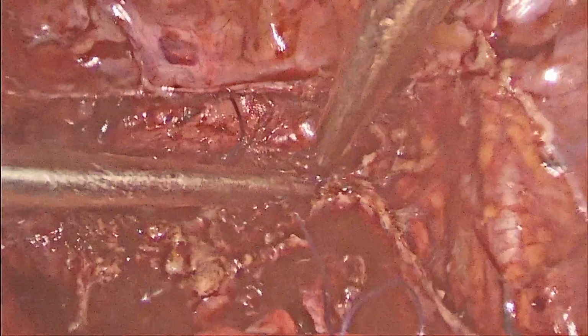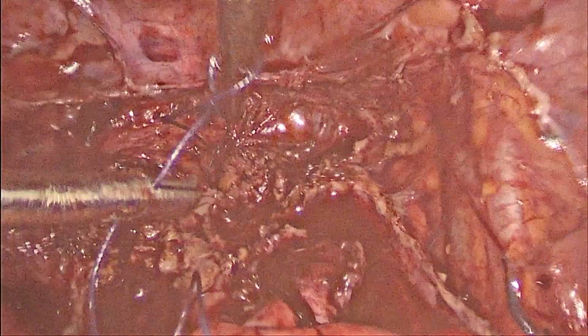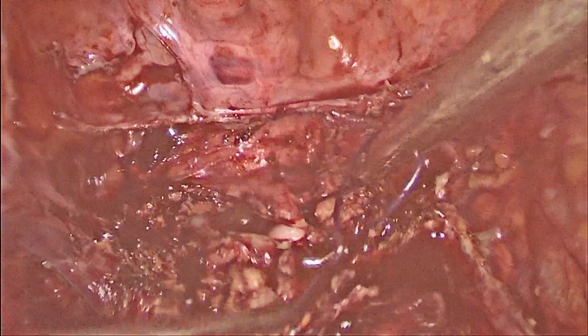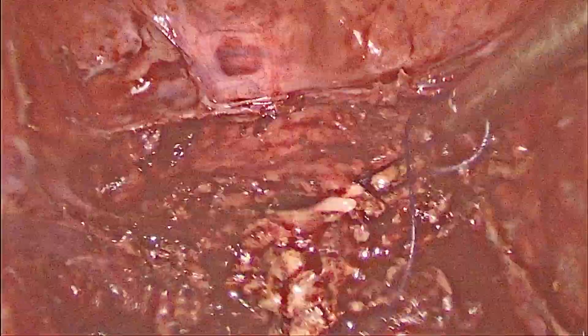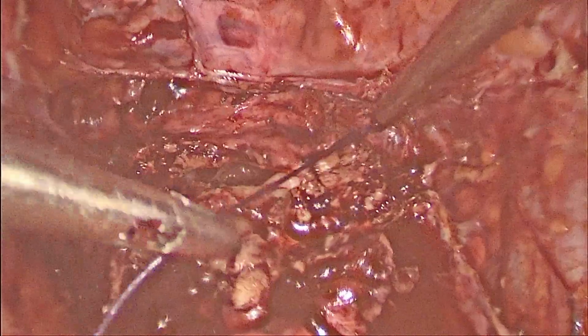Usually 4 knots are taken, and 2 stitches are taken, one on the right side and one on the left side, including the uterosacral ligament on either side of the vault, to prevent vault prolapse in future.